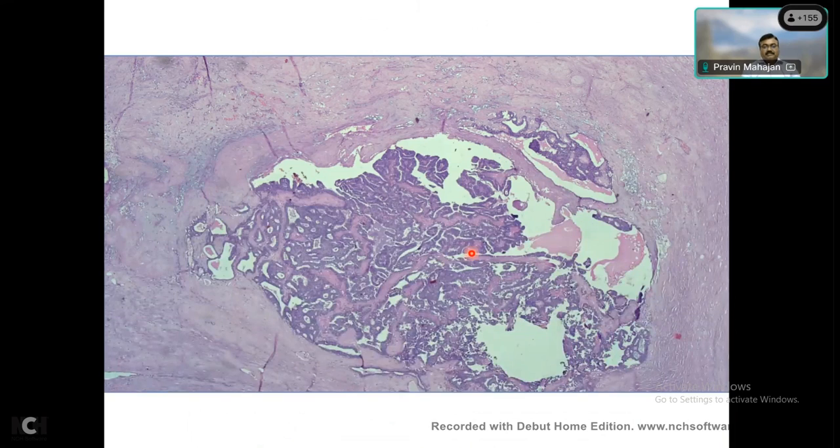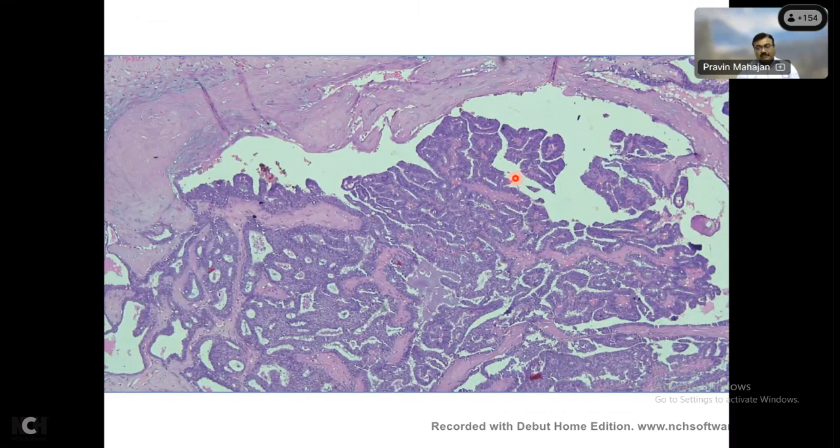So now look at this one example. You have a very thick fibrous capsule of a lesion which is quite nodular or encapsulated, and within that you start to see this papillary lesion. Even on the low power, what is different from the papilloma which was seen earlier is that this lesion to me at least looks quite blue. You start to see this very blue looking papillary proliferation. The papillae are quite slender here. They're not very broad like what you saw in papillomas.